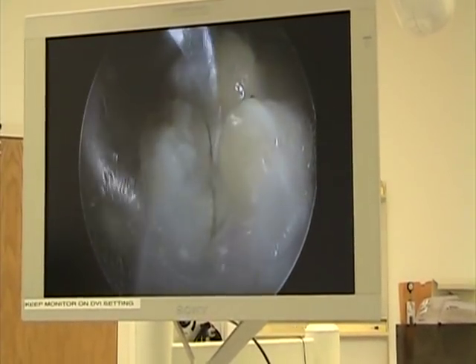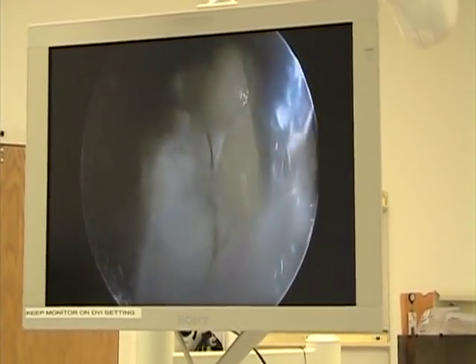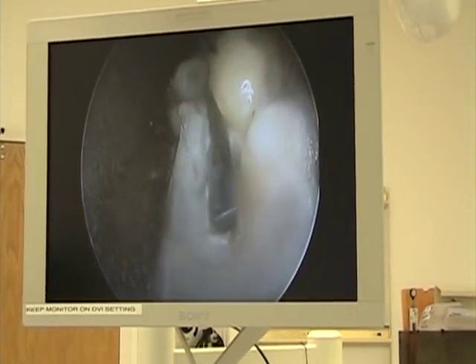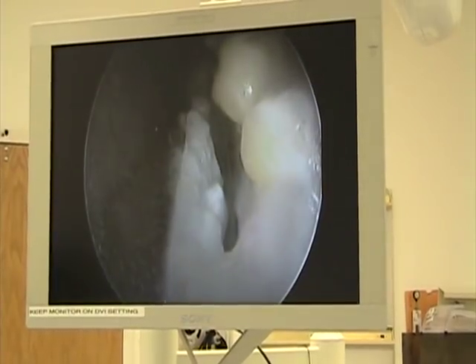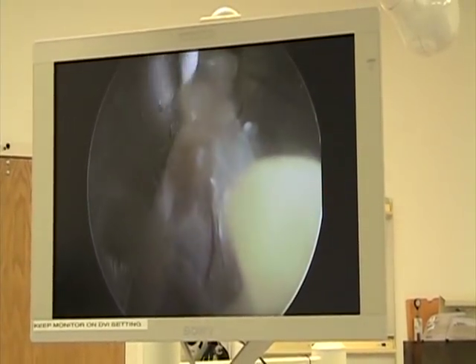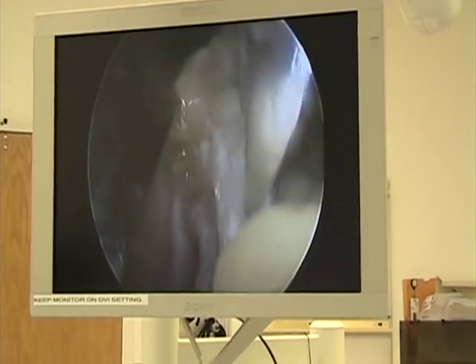What we're seeing is a little bit of adipose tissue here, but down at the tip we can see a more dense fiber, which is the plantar fascia. So we're seeing the walls of the plantar fascia and we're trying to make a complete release.